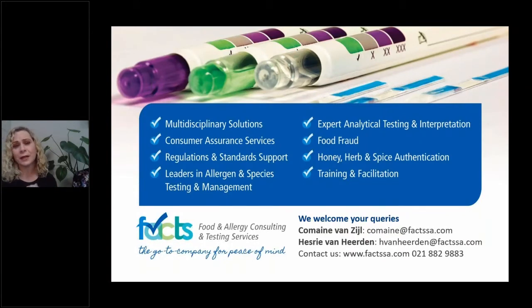Just as a side note, that is what we typically call recoveries, and that is part of method validation when it comes to accreditation of the method in the case of the lab. So that's really where you're wanting to make sure that the control is being done up front, and that all of that work is being put into the test kit, so that when I use the rapid test kit, I'm relying on validation that's happened in the laboratory to ensure that it will detect at the specific levels that it is supposed to detect at.